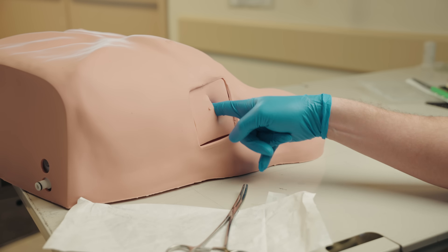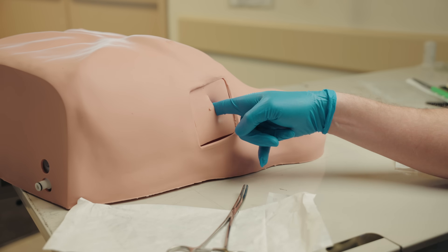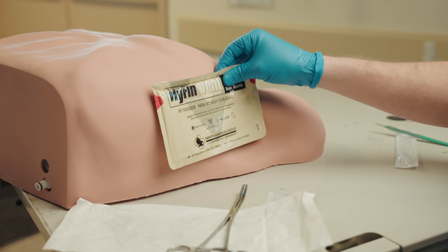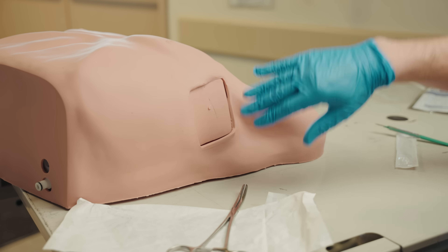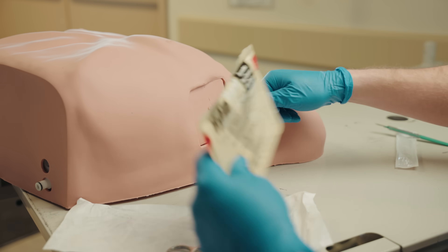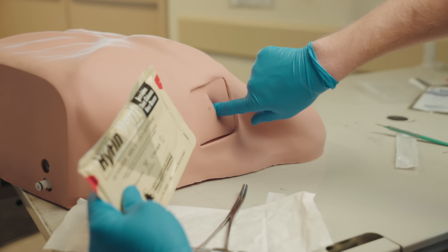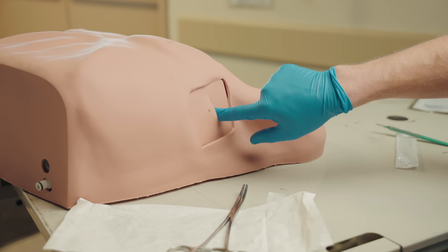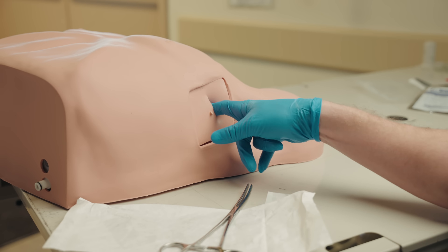Once this is relieved, we've hopefully heard that whoosh or the patient's hemodynamics have started to improve. Then I'm going to take my finger out and apply some kind of occlusive dressing — a vented chest seal. If the patient experiences this pneumothorax again, all I have to do is peel back that dressing, get my finger, and reopen the finger thoracostomy — I don't necessarily have to cut again. It is really important that we're cutting on the lower rib and then moving up over it, so we're avoiding that neurovascular bundle.